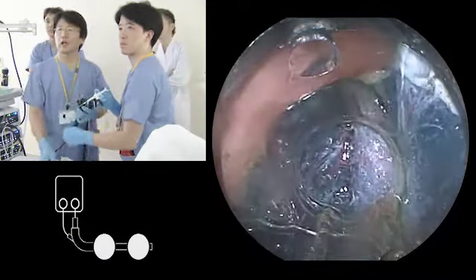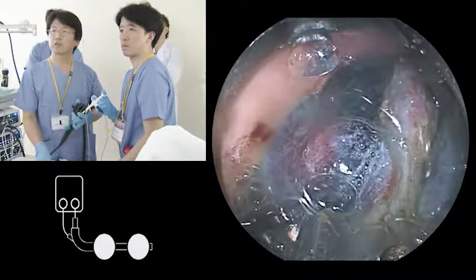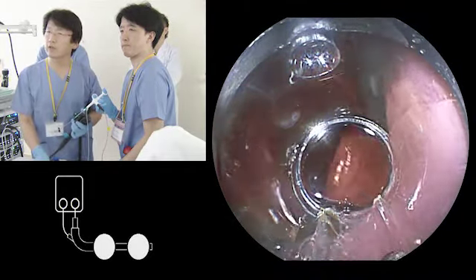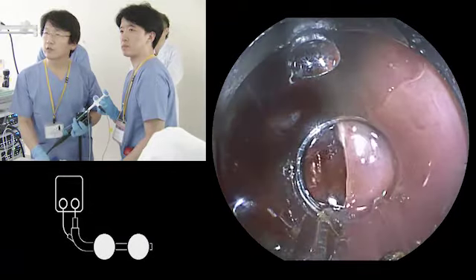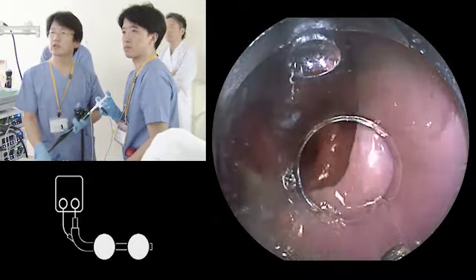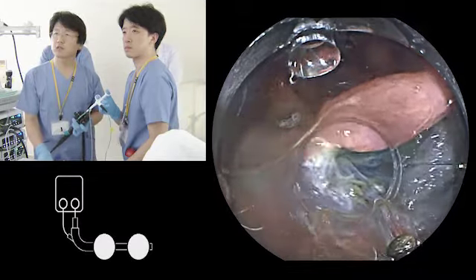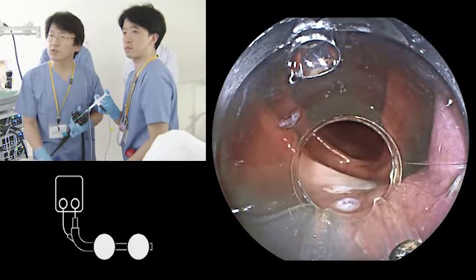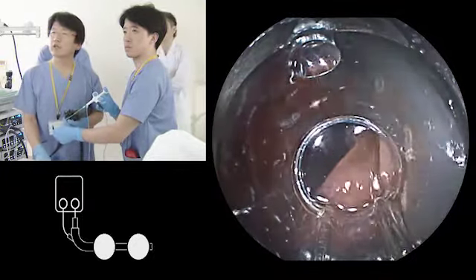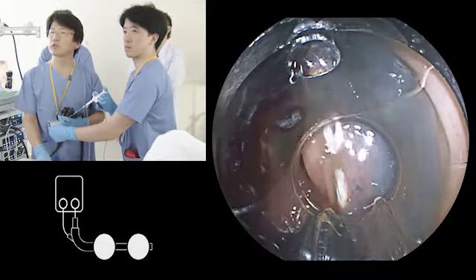And then after creating a pocket, you can measure the depth of the pocket against the length of the lesion from outside and inside, and this is the mark. So I think this is deep enough, and this side, this is the edge of the pocket, this is the edge of the lesion, so this is wide enough. And on this side, I created a pocket, but I have to open the mucosa here.